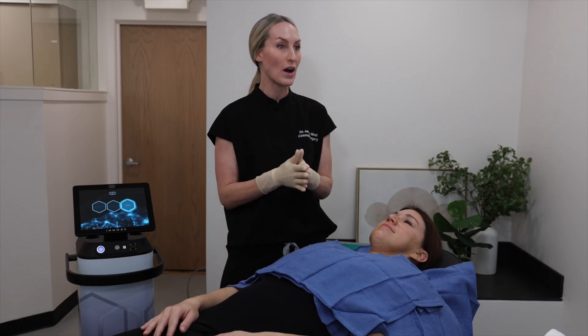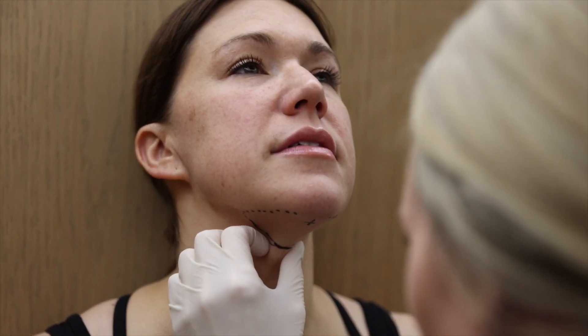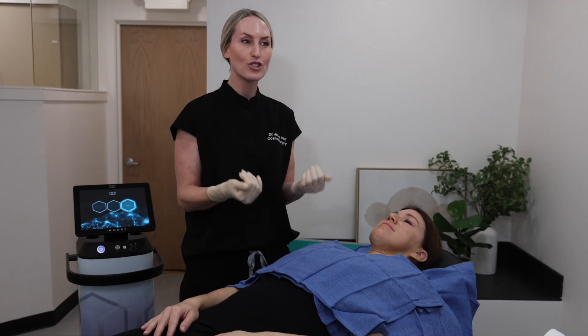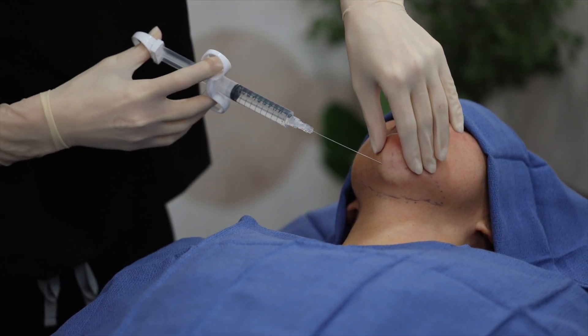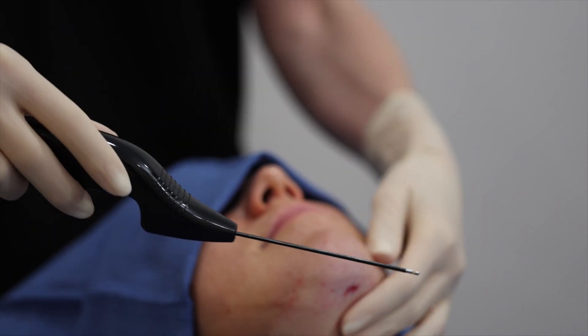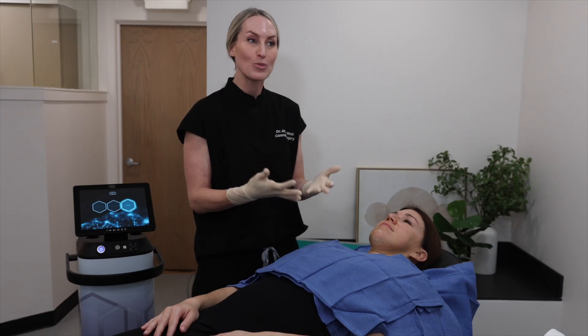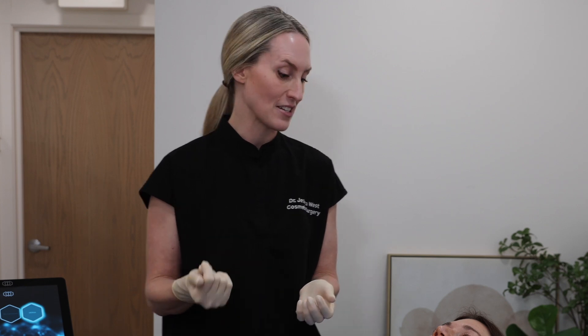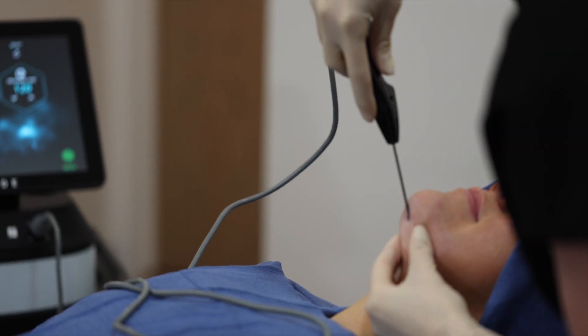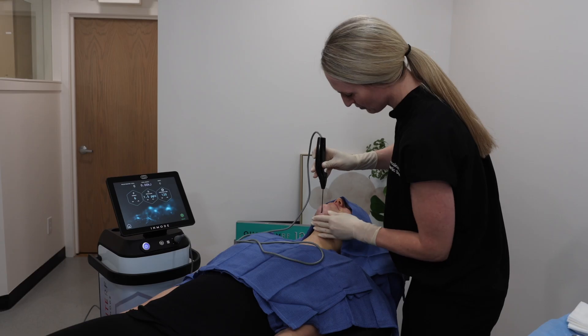We'll be starting the Quantum 10 procedure for the submental area. What we have here is just this little tiny pocket of fat under the chin. I'll start off by numbing the area, then make a small incision and introduce the Quantum 10 probe. When the probe's under the skin, we'll use the radio frequency energy to create small micro pockets of fat destruction — essentially melting fat and tightening skin simultaneously.